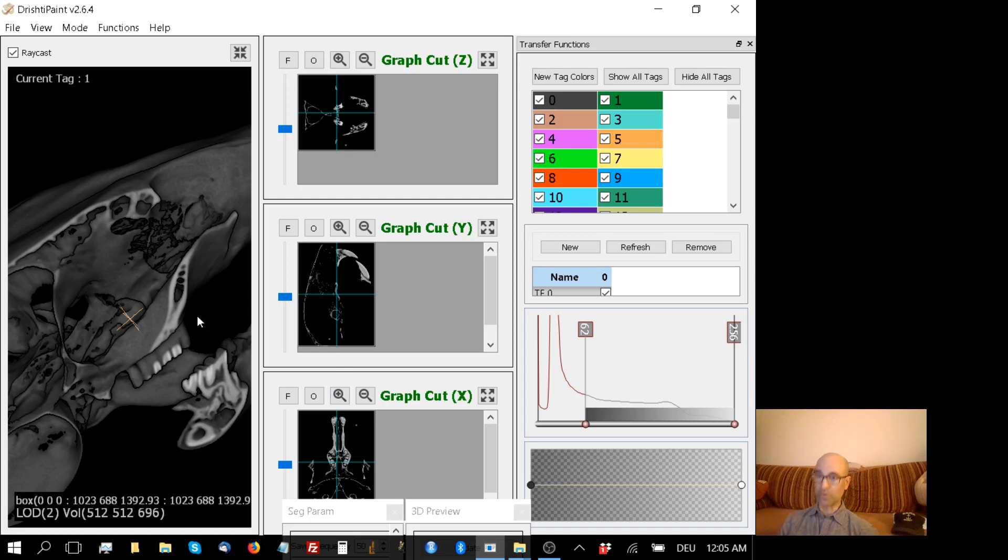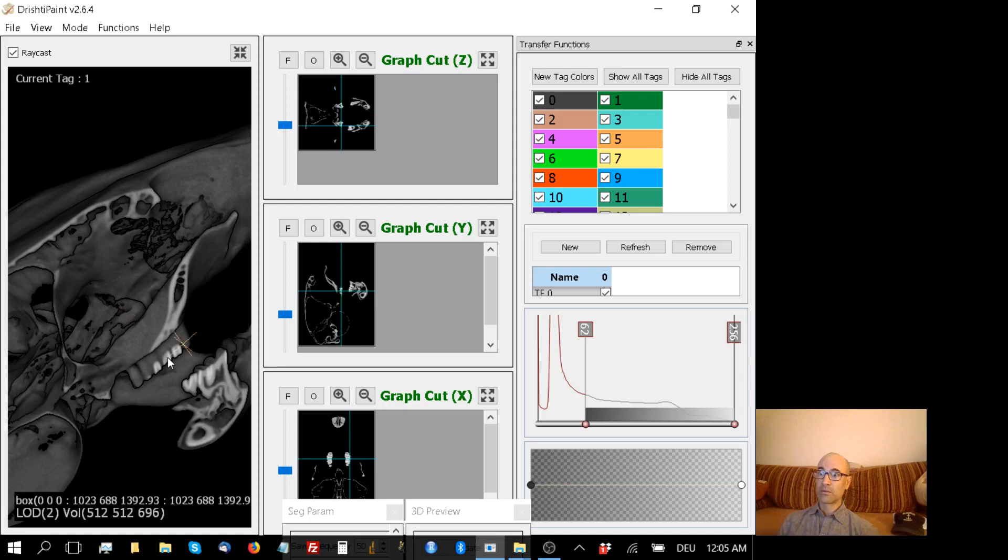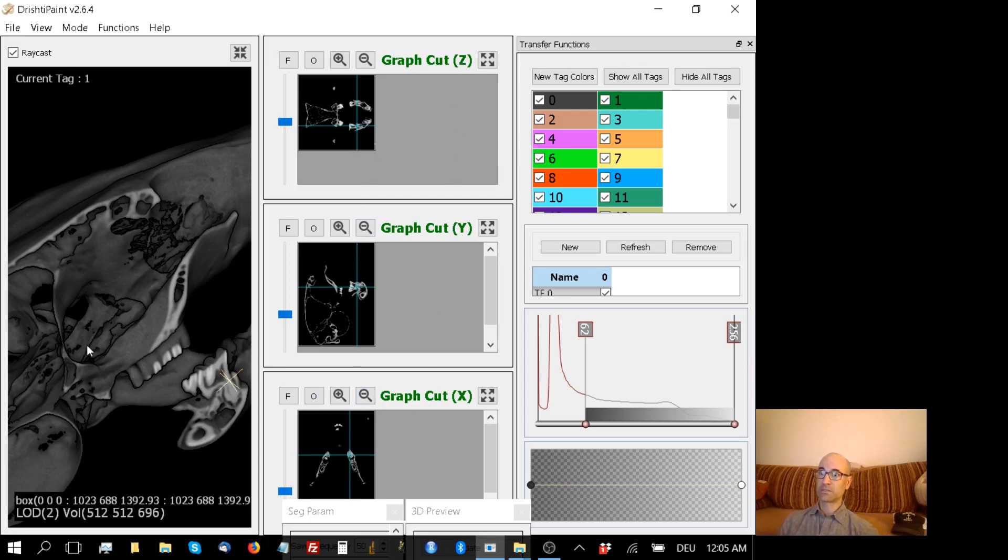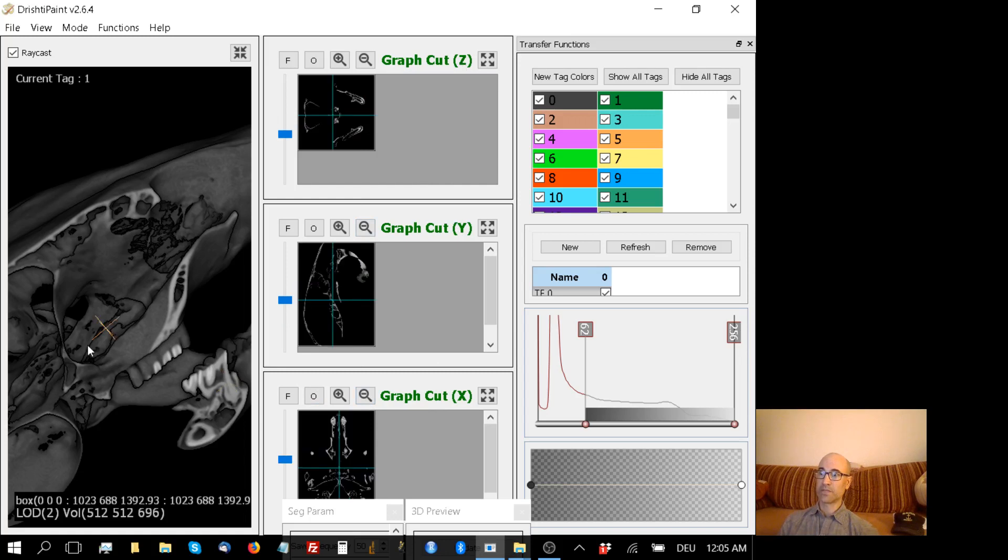This little cross here represents where all of the 2D slices are located. So if I hit control right-click, I can move to a different part, and you'll notice the cross moves both on the 3D preview window and in each one of these 2D slice windows. So I have a Z slice, Y, and an X slice. That's very useful.